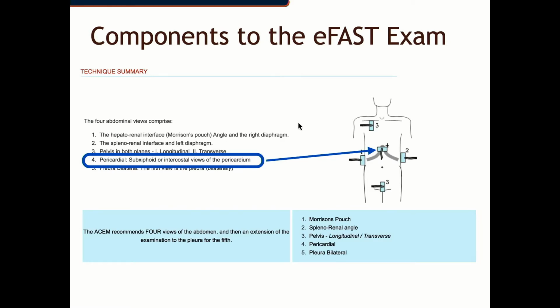I'm going to step you through a parasternal, an apical, and then a subcostal view so we can pick the best view. If I were scanning a true eFAST, when I get to the first acceptable view, I'm going to get that clip and I'm done.